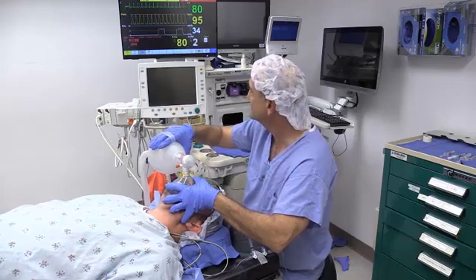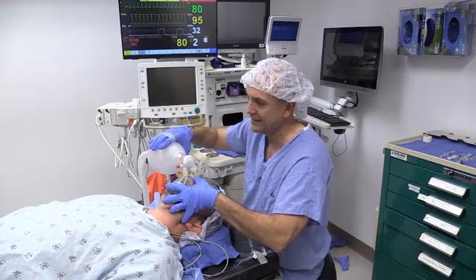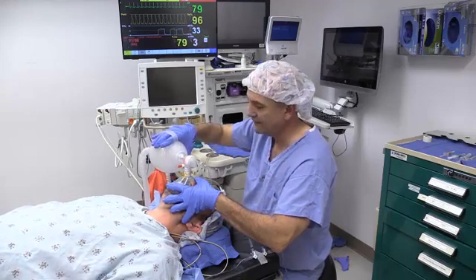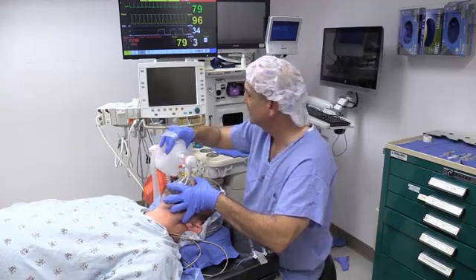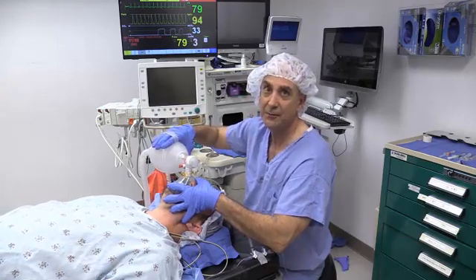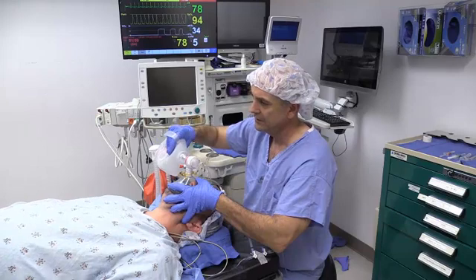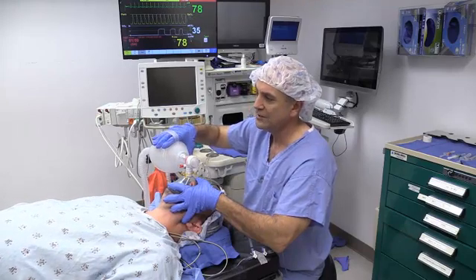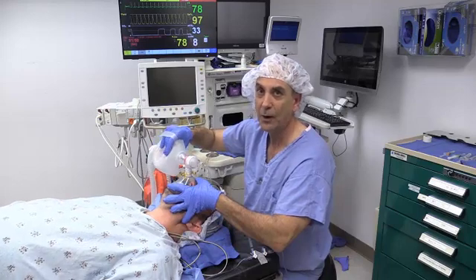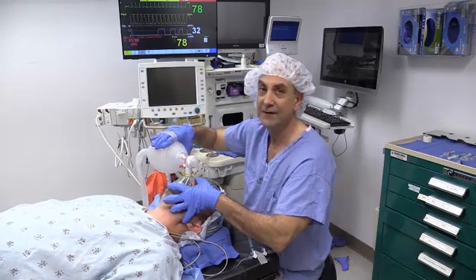You'll also notice that all of a sudden I have end-tidal CO2. Not only a waveform, but a quantity. You'll also notice here that the oxygen saturation is coming up. So Mr. Jones was indeed apneic. I placed an oral airway and then ventilated him.